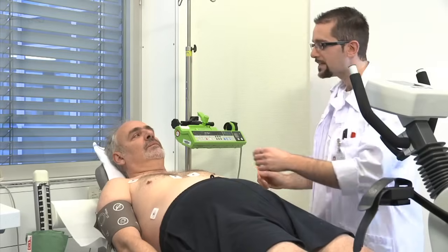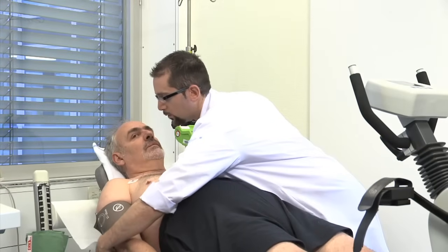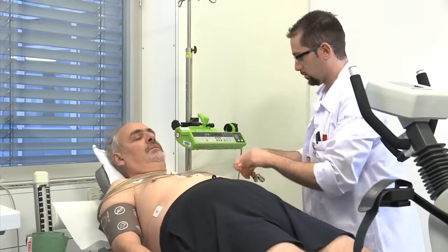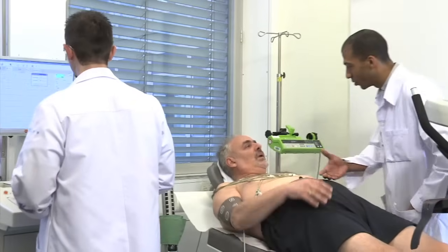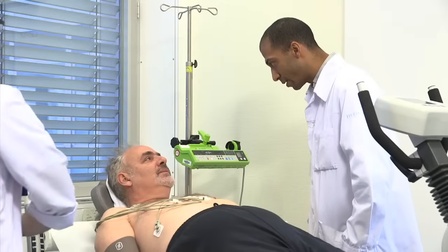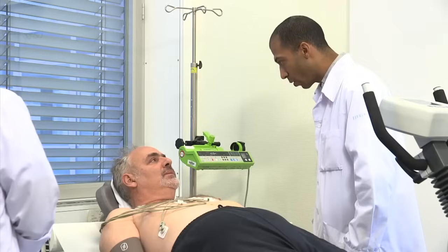Cette partie va durer maximum 15 minutes. On ne va pas vous faire pédaler bien longtemps. Bonjour monsieur, je suis le docteur. Pour cet examen, on va vous faire un test d'effort et au maximum de l'effort, on va injecter un traceur qui va nous servir à faire des images plus tard.